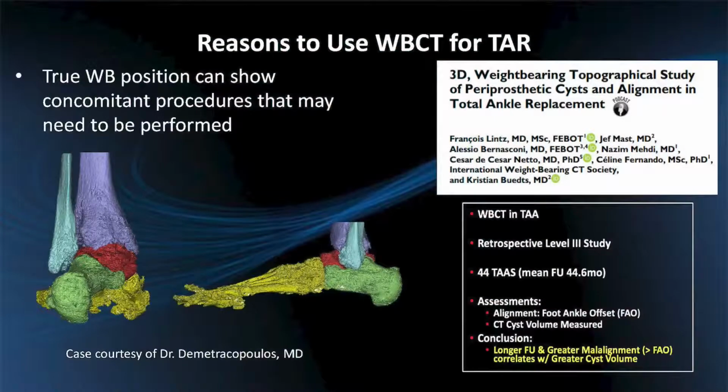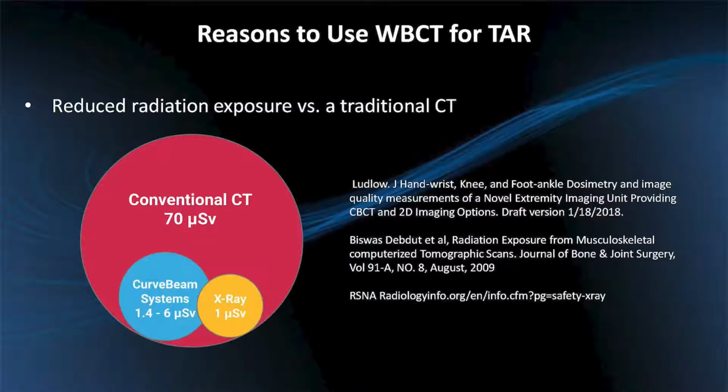This has been looked at more carefully, and as you know, there's a lot of research in weight-bearing CT, so my charge is to apply this to give the best patient outcomes by studying weight-bearing CT as it relates to total ankle replacement. And there's always a concern: if you're doing a lot of weight-bearing CT, what's going to be the radiation exposure for the patients? It's a very low radiation level when compared to a traditional CT scan. I think that's really important, and I learned that.